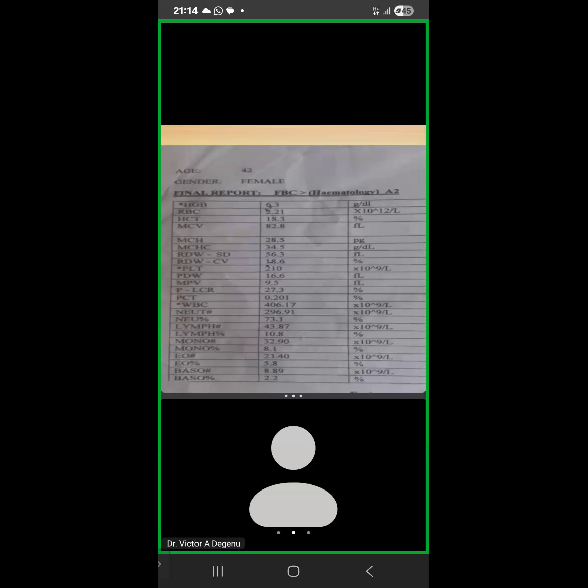I find it difficult to read, but what I can get from it is that the RBCs that we are seeing have variations in size. That's what you may expect on the film because of the anemia deficiency.